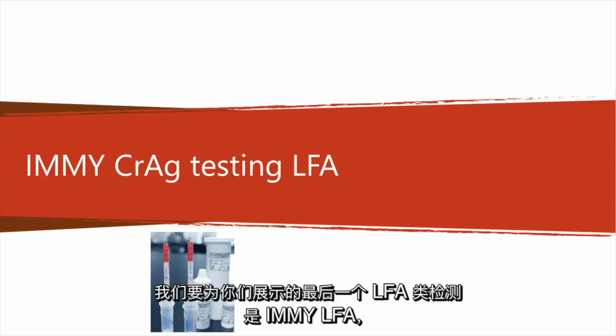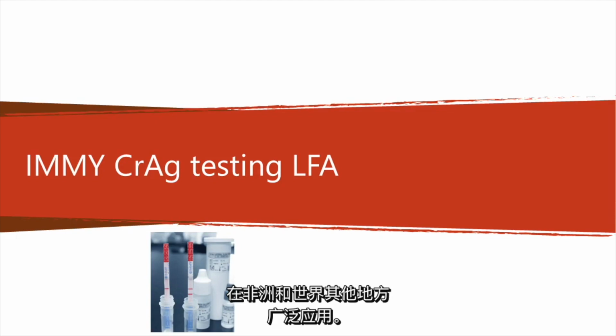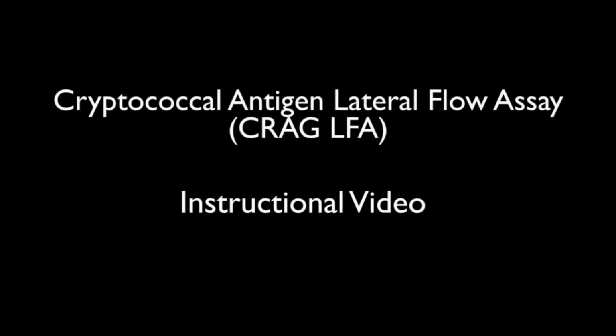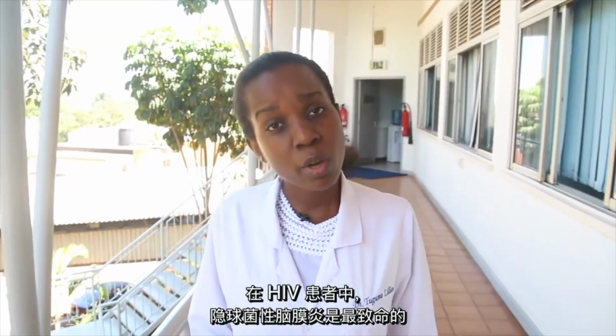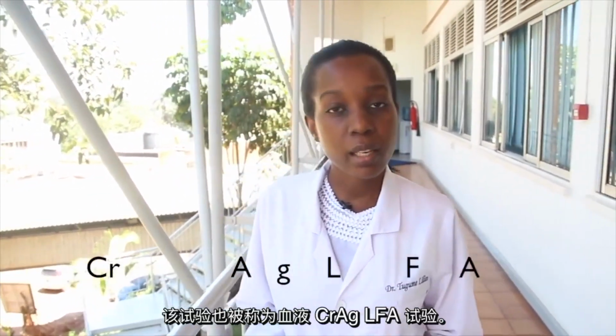And the final assay we're going to show you of the LFA variety is the LFA which was the first to be launched on the market and is used extensively in Africa and other parts of the world. Cryptococcal meningitis is one of the deadliest opportunistic infections in HIV patients. It accounts for about 500,000 cases per year. Early detection is key to improving outcomes, and one of the ways to do this is by performing the cryptococcal antigen lateral flow assay, also known as the CrAg-LFA, on blood. And here is how to do it.